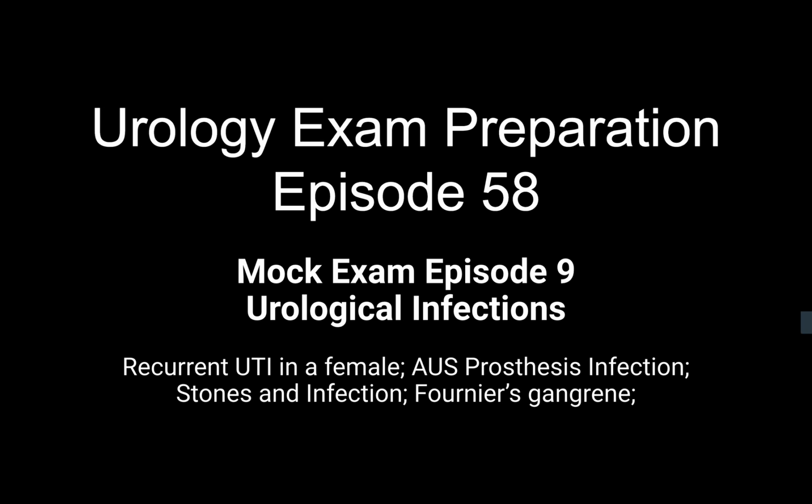Technically, it will be an incision in the penoscrotal junction, and the cylinders will be placed in the corpora, and the patient will have a pump in the scrotum and also a reservoir in the lower abdomen in the rectus suprapubic space. Okay, sorry to interrupt. We are planning for artificial urinary sphincter in a patient with previous prostatectomy related incontinence. Can you revise your implants?